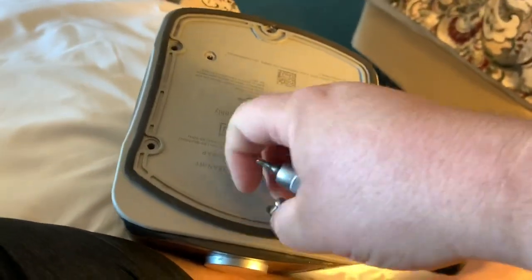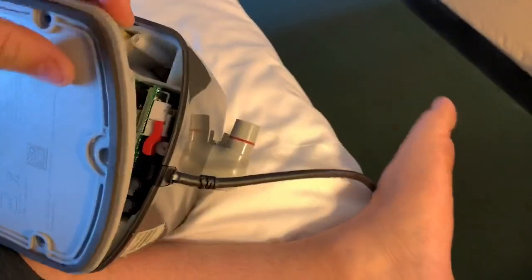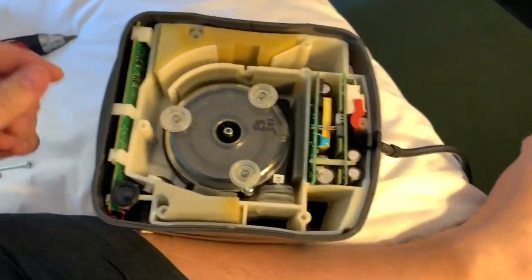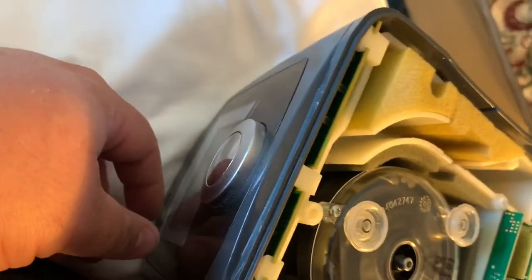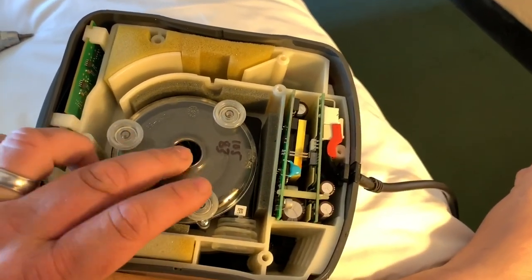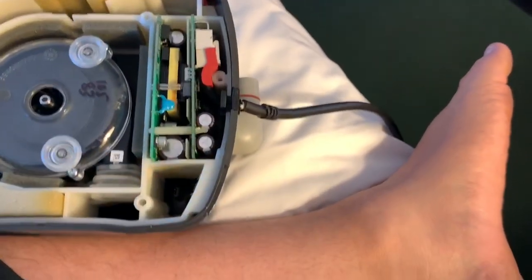Once you have all of the screws removed, set them to the side. You want to take this cover off — it pops off fairly easily. You just grab the bottom and it pops off. Once it's open, you see you have the control board up here for the front controls, a couple of sponge-looking insulators, there is your motor, and here is the main board that the power cord and everything hooks to.